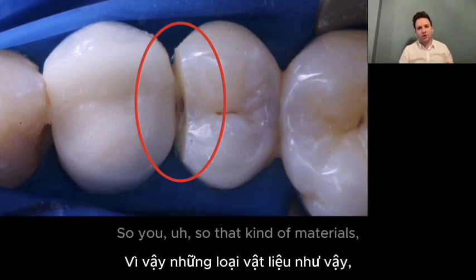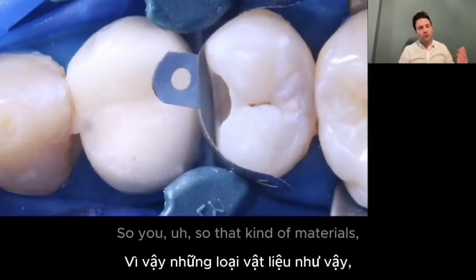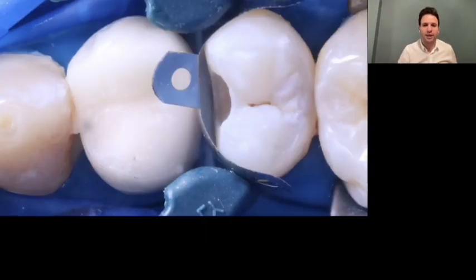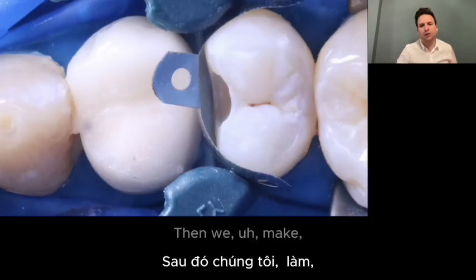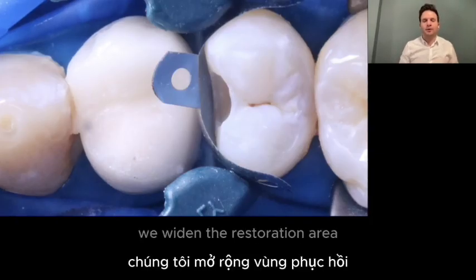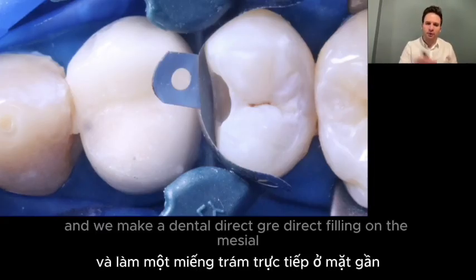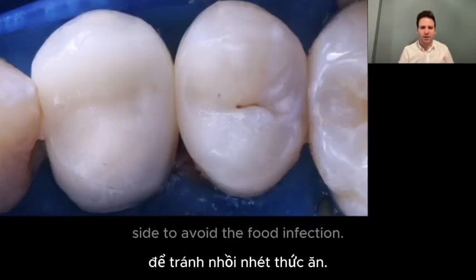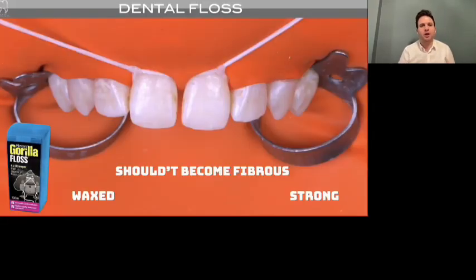So that kind of material, wedge guards, is very useful to protect the adjacent tooth. Then we widened the restoration area, and we made a direct filling on the mesial side to avoid the food impaction.